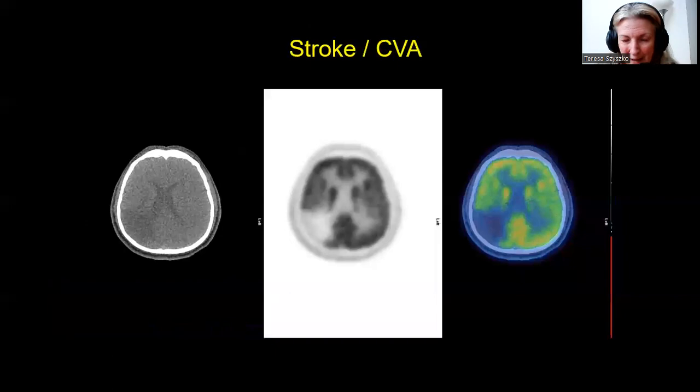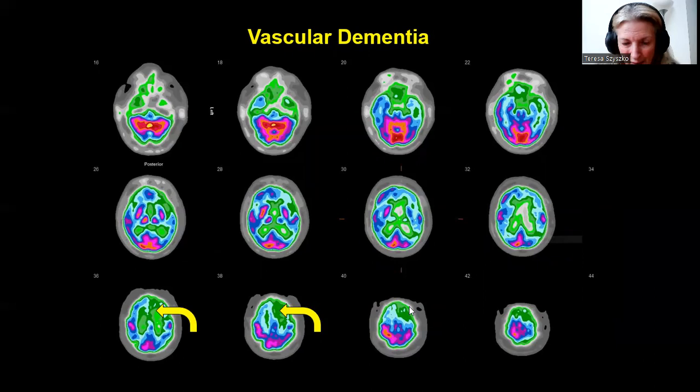Here we have a large stroke — a large photopenic deficit in the right parietal region with corresponding low density on CT. Here we have another infarct in the left frontal area with quite marked left frontal hypometabolism. You can have multiple infarcts or a single infarct — this is vascular dementia.